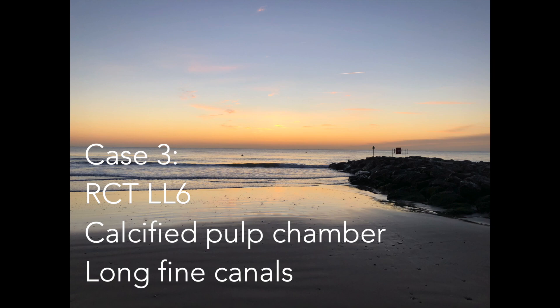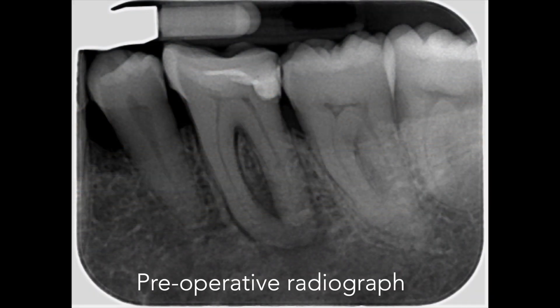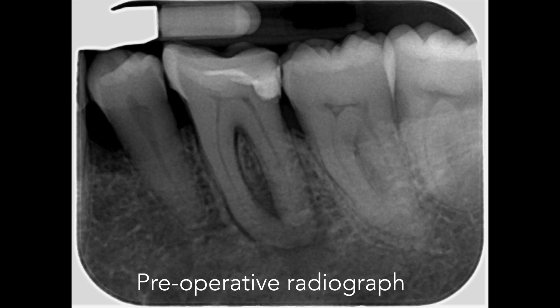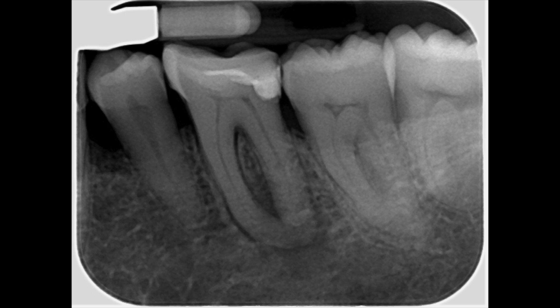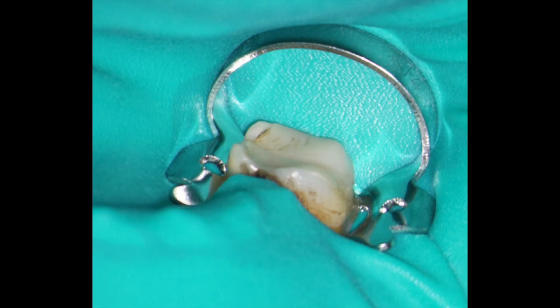In the final case we're going to be looking at another mandibular molar. In this case it's a tooth where the pulp floor and roof are almost on top of each other. There's not much space there, and we need to select a reference point that will allow me to penetrate that without risking perforation of the furcation. I can see a handy dip in the restoration on the radiograph that correlates nicely with the view when the tooth is isolated under the microscope.